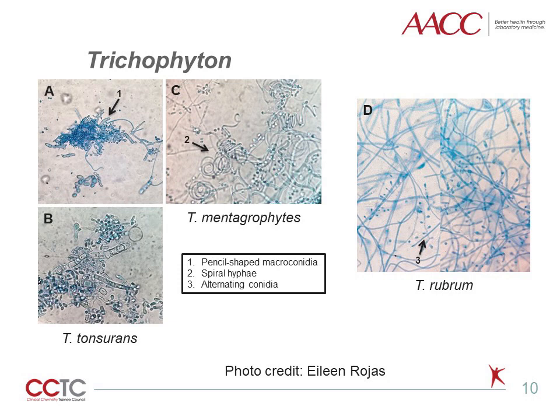Lastly, Trichophyton rubrum is shown in Figure D, where we can see numerous teardrop-shaped microconidia still connected to the hyphae. We also see characteristic alternating conidia at arrow 3. So while these organisms are all from the same genus, they will look very different microscopically. T. tonsurans can produce many different types of conidia, both the larger macroconidia that can have a pencil or club-shaped appearance, to the smaller, more abundant microconidia that look more like teardrops or matchsticks.